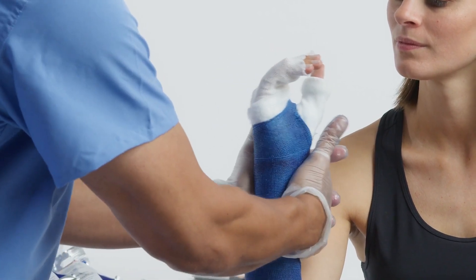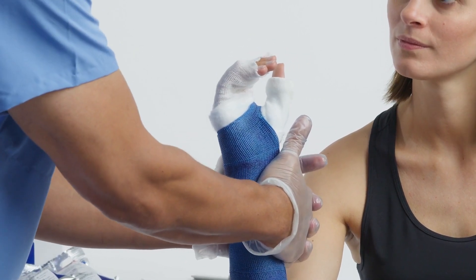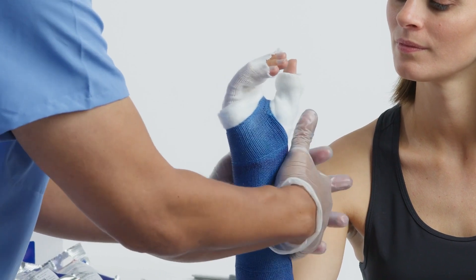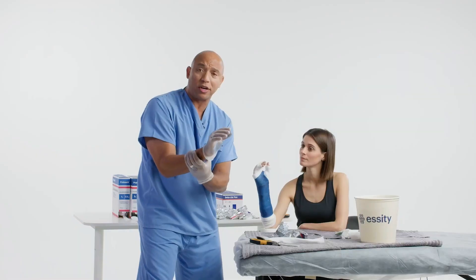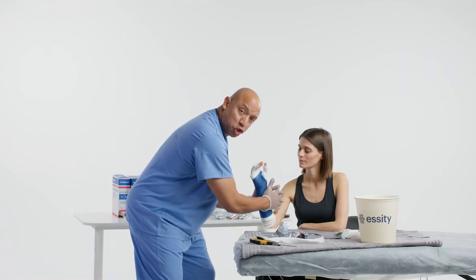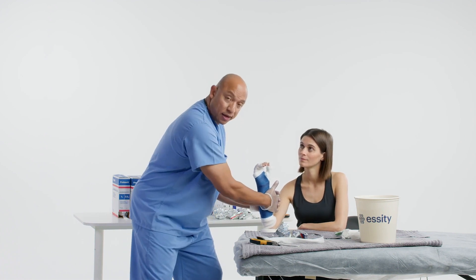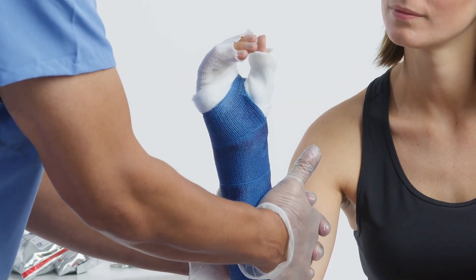You don't want to press in the area where the patient flexes the wrist because that's where the nerves are — concentrate on the forearm portion. Hold that three seconds or more and then work your way down. It's imperative that you don't let the patient supinate or pronate afterwards because what they're doing is opening that spot up. A short arm cast is going to limit supination and pronation — it won't stop it, but it will just limit it.